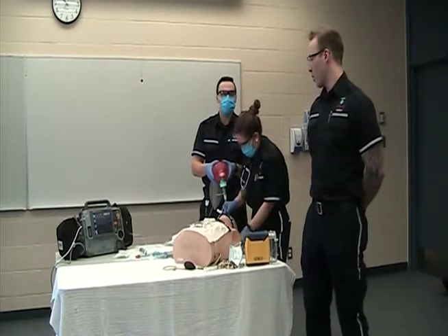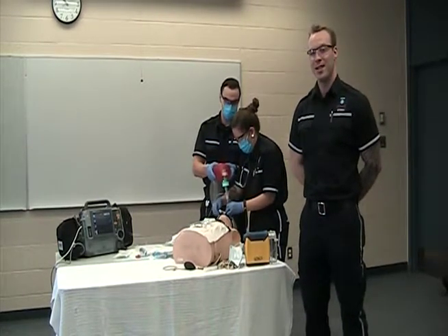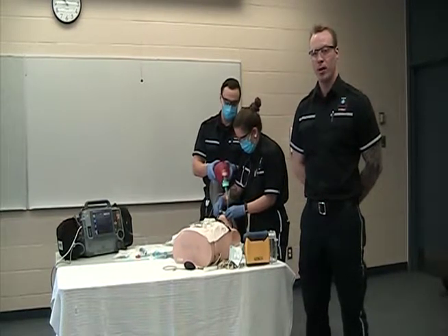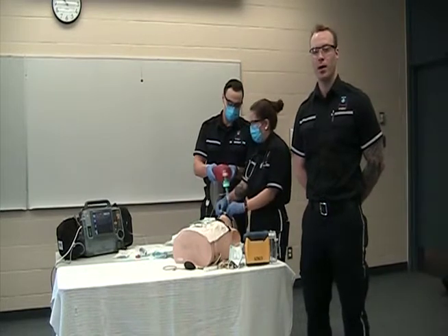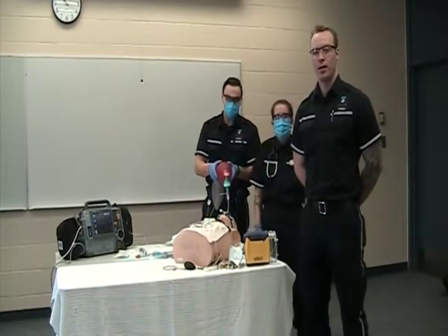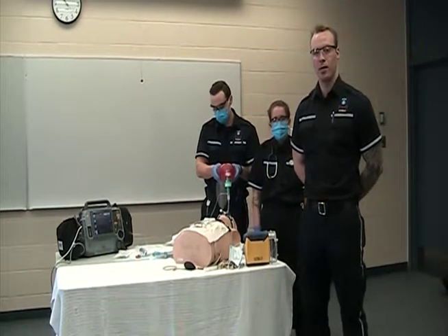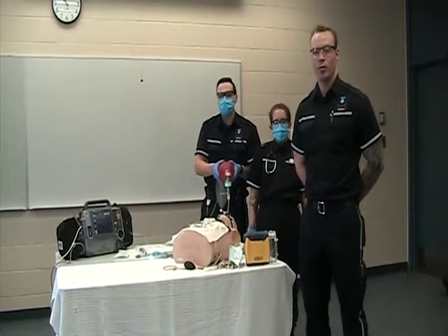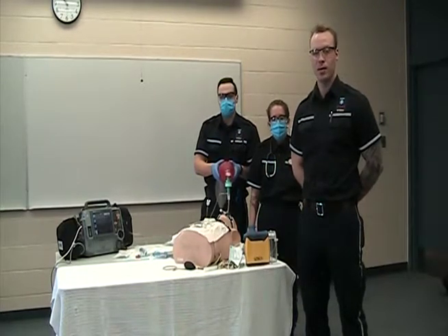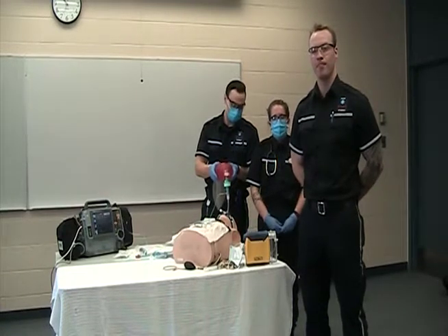Now, if we had any problems bagging, we'd go through our DOPE mnemonic. So starting with D, any displacement of the tube. So we want to make sure the tube is at 22 centimeters. If we've moved the patient into the ambulance or out of the ambulance, the tube may have been displaced, so we can simply fix that by deflating the bulb and retracting the tube back to 22 centimeters. There might be any obstructions for O, so that could be blood, pus, emesis coming through the tube, which we can fix with deep tracheal suction through the tube.